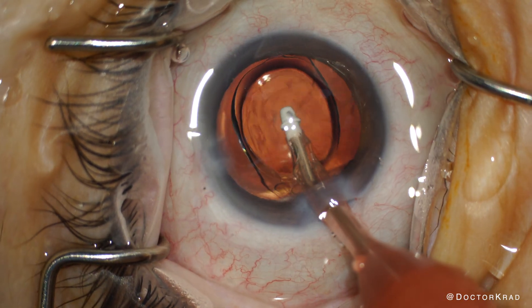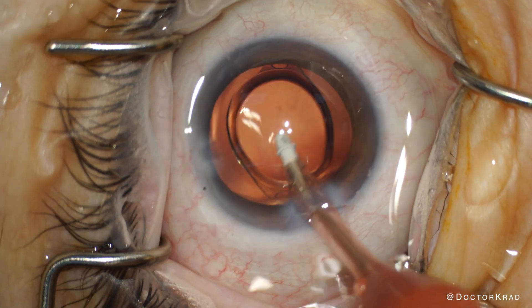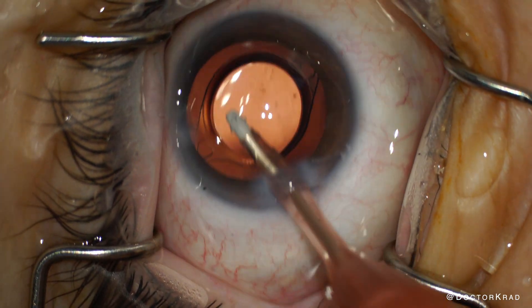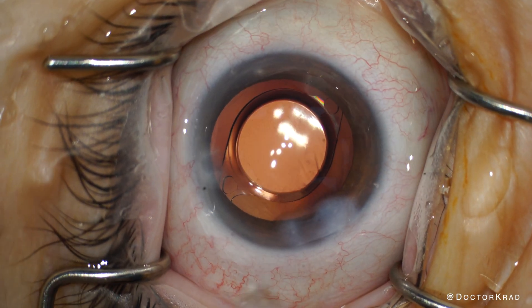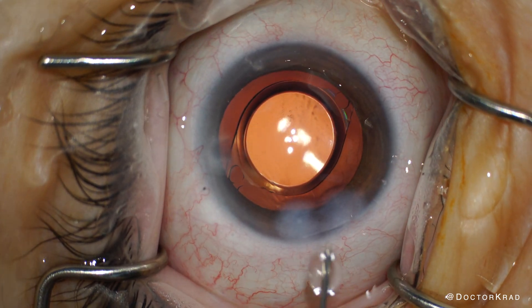Next, we're going to remove the viscoelastic gel from the eye. The removal should be thorough to decrease the risk of a postoperative pressure spike. Also, search for any residual lens fragments in the eye. After that, we ensure that the IOL is well-centered, hydrate our incisions, ensure that the eye pressure is normal, and ensure that the incisions are watertight.